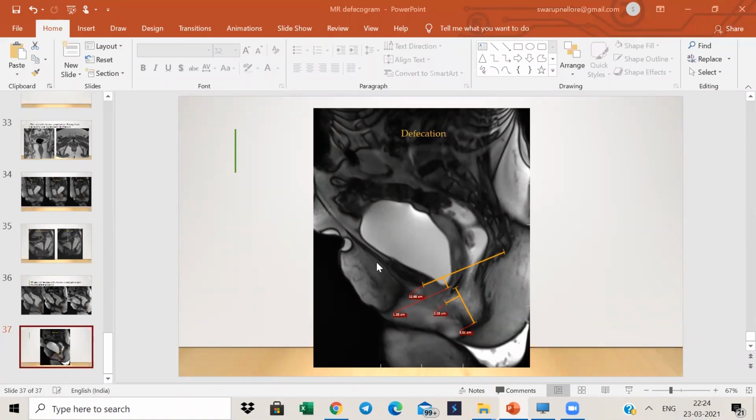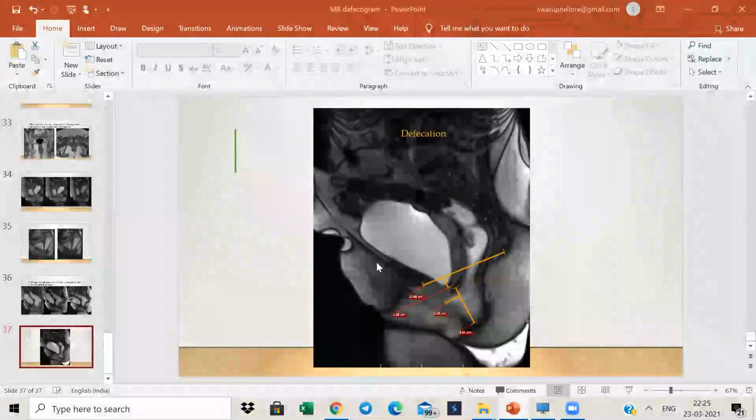How do we report, or what is the pattern or format of reporting? The initial part of our report normally takes the structural findings into consideration. So we start off by talking about whether there is any evidence of an endopelvic fascial disruption. As sir told you, if there is a change on the axial images in the contour of the urethra itself or the vagina, those would be indirect evidences of a disruption of the fascia. Then we would talk about the levator ani muscles itself. We would look on the coronal images to see if you can identify the normal umbrella shape of the iliococcygeus. At the same time, look at the puborectalis sling, whether there is any asymmetry between the sling on either side. Look at the fibers of the levator ani itself, showing any kind of thinning, asymmetry, or change in the continuity of the fibers. We will talk about them.